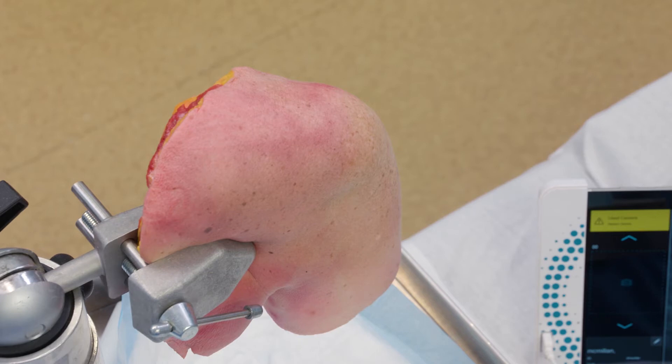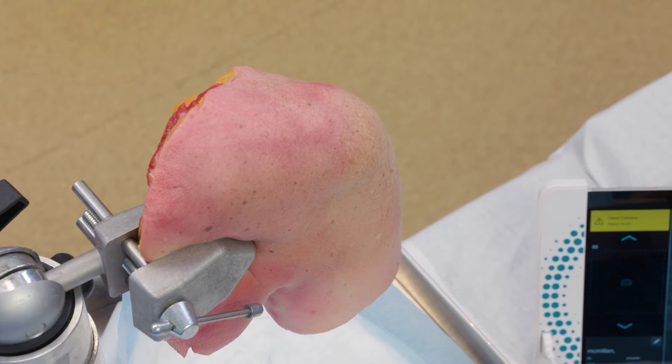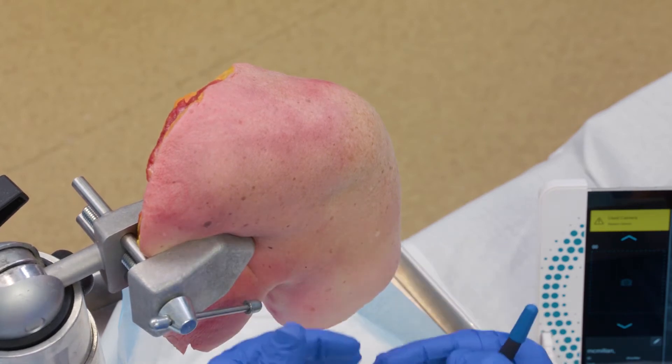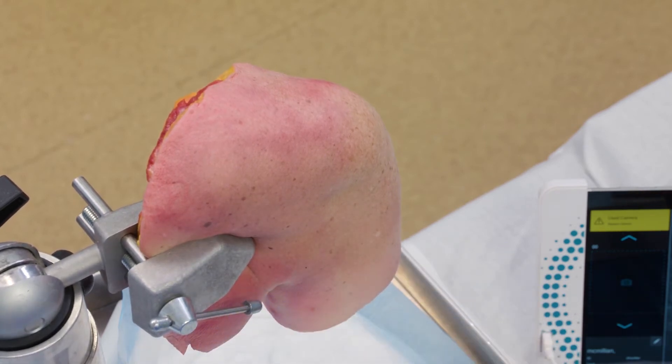For the shoulder, there's two different ways you can go about this, and it's more or less a surgeon comfort. I usually have them sitting up in a beach chair position, just in a chair. I'll drape them out a little bit, expose the shoulder, and take some sort of chuck and put it behind them so we don't get any fluids on their shirt or their clothing.